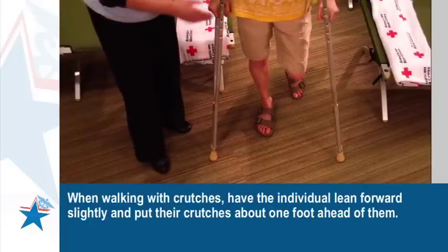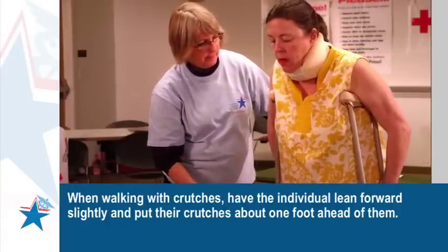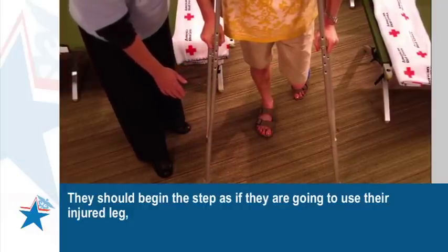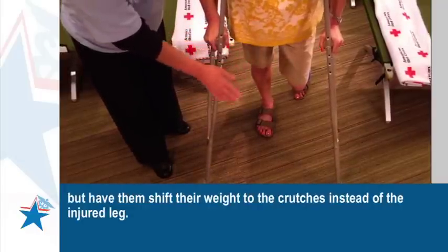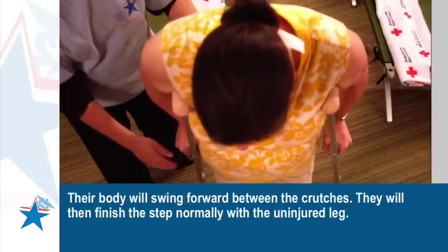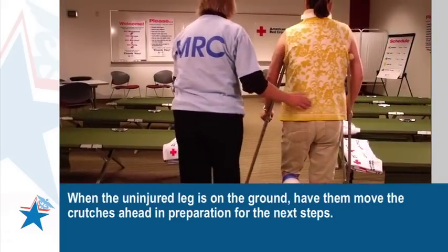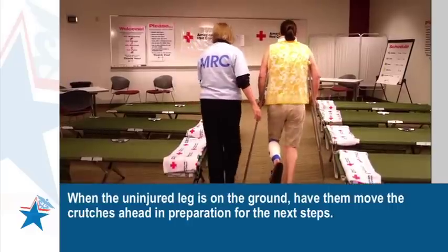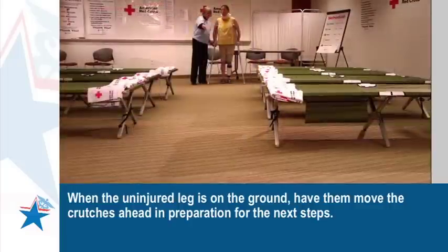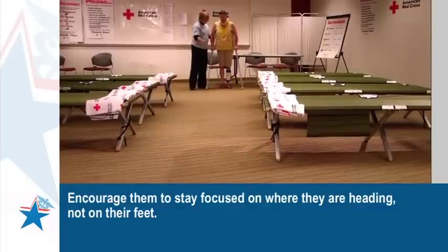When walking with crutches, have the individual lean forward slightly and put their crutches about one foot ahead of them. They should begin the step as if they are going to use their injured leg, but have them shift their weight to the crutches instead of the injured leg. Their body will swing forward between the crutches. They will then finish the step normally with the uninjured leg. When the uninjured leg is on the ground, have them move the crutches ahead in preparation for the next steps. Encourage them to stay focused on where they are heading, not on their feet.